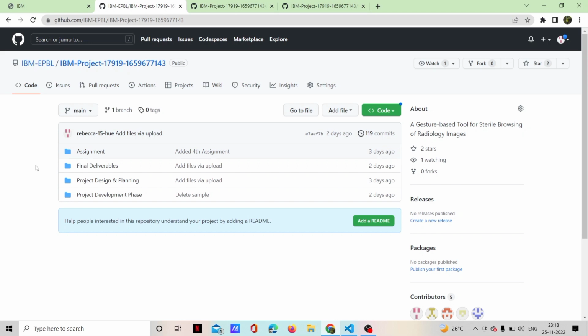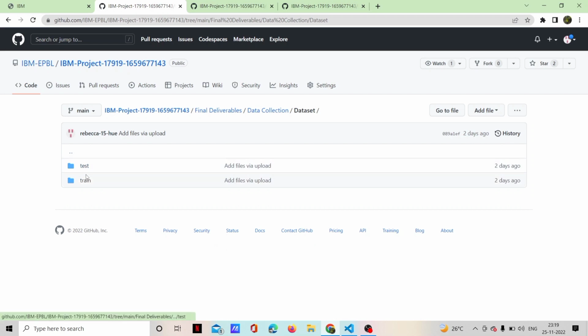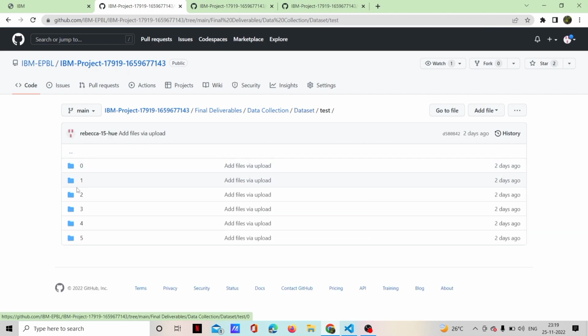So the first step in our development phase is dataset collection. We have downloaded the dataset from the provided link in IBM. So the folder consists of two files containing images of hand gestures from 0 to 5, which is used for testing and training the model.